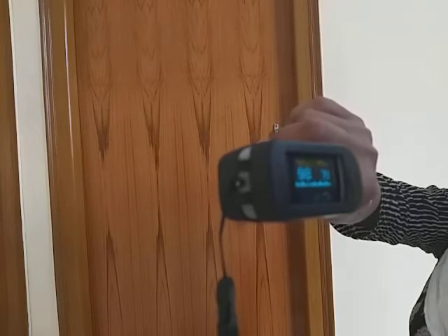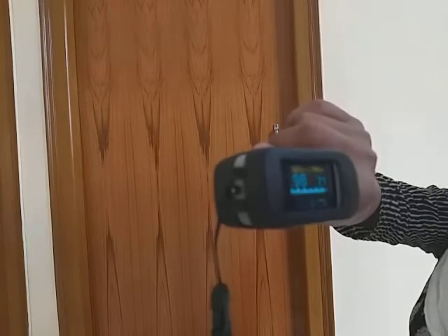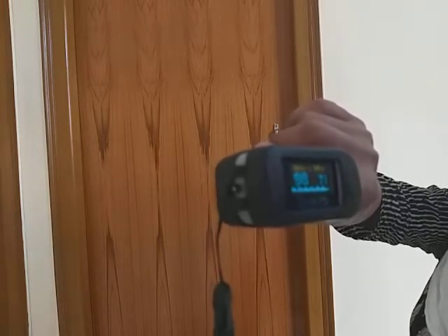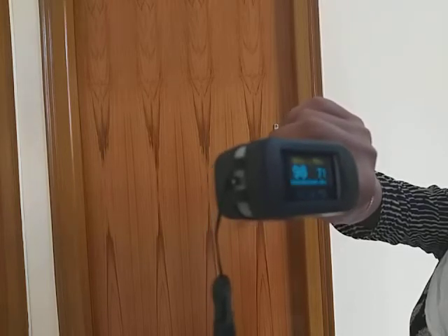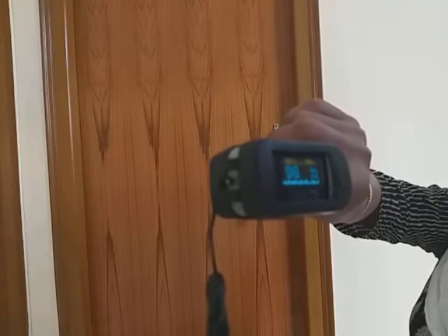So she is perfectly normal. The trend shows she will not have any more dip in saturation, and the pulse rate has well settled to 71-72 per minute by 50 seconds. This is the two-chair test.